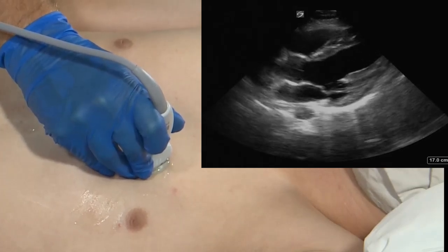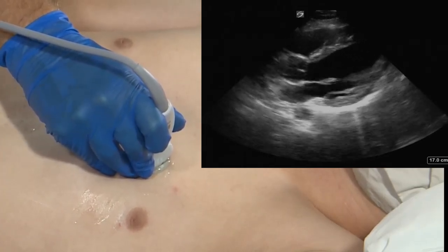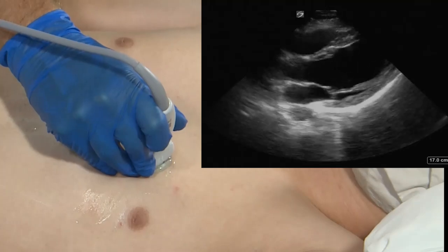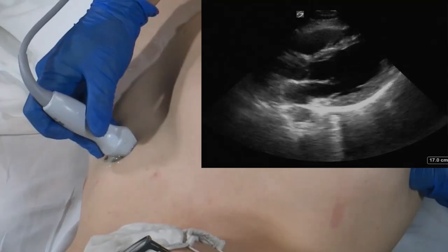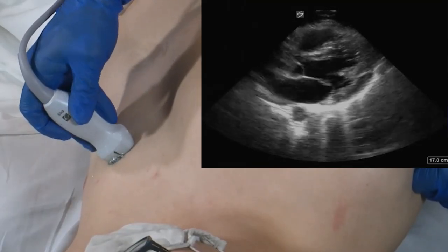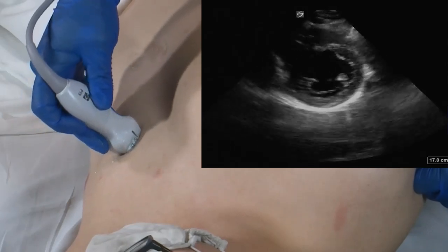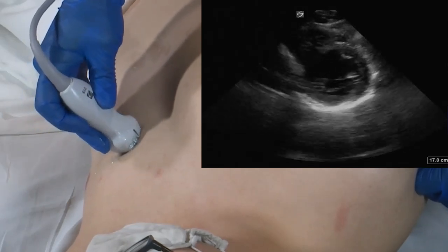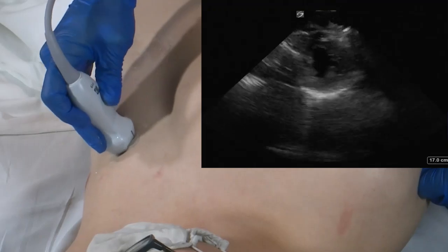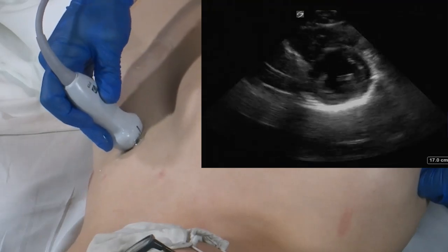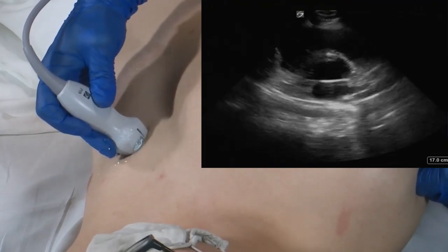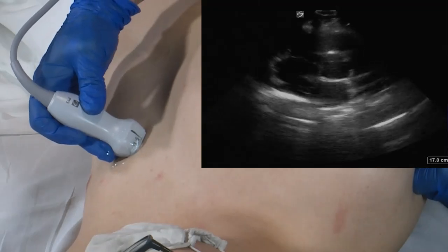Once we have obtained a satisfactory parasternal long axis view, we're going to move towards the parasternal short axis view. We will do this by rotating the transducer towards the patient's right hip. In this orientation, we're going to fan the transducer up and down, looking at the apex, the mid portion of the left ventricle, the mitral valve, and up towards the base of the heart.